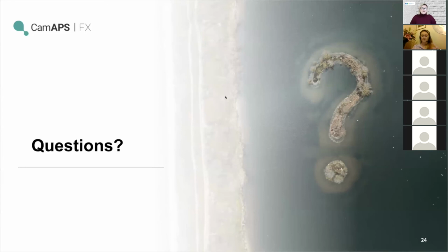Thank you. So this is a question in regards to ease off, and thinking probably in terms of a temporary basal rate on a pump. Are there different levels of ease off for lighter exercise versus heavier exercise? No, there isn't. There's just one ease off function.